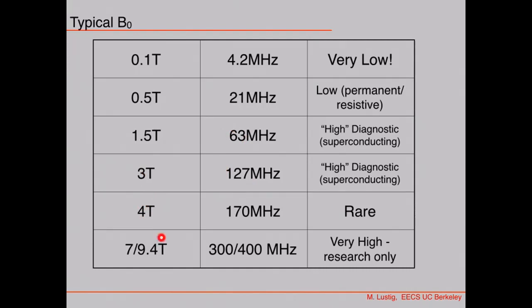And then ultra high field, which is 7 T and above. 7 T is actually FDA approved now, only recently, in the last couple of years. And there are also existing 9.4T and 10.5T scanners. I think 11.6 is in the making or already existing. There used to be an 11.6, but it quenched.